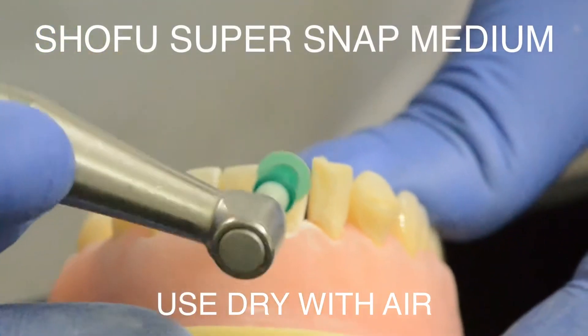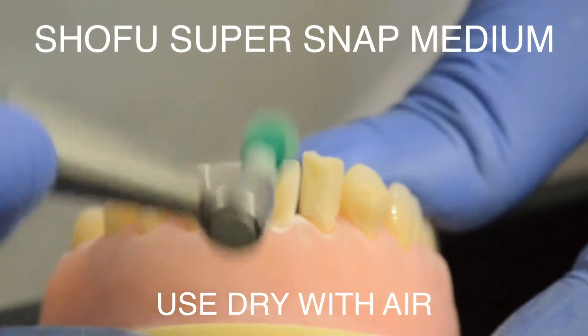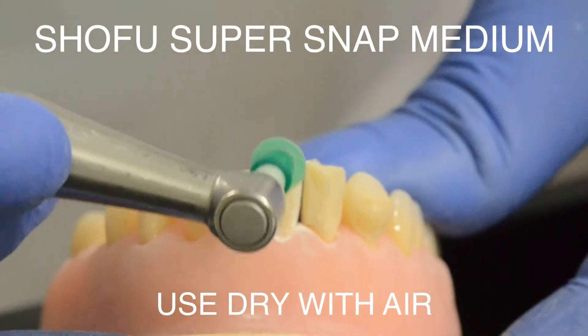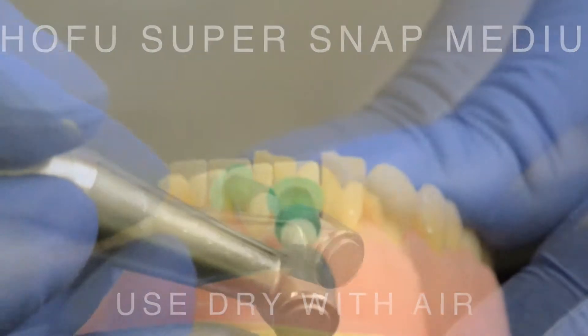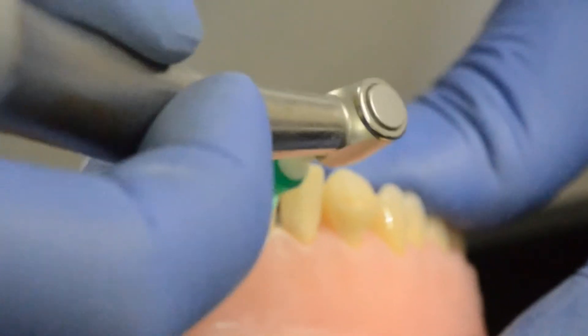Step number three is to use a medium grit diamond disc. In this case I'm using the green color Shofu SuperSnap. You may use anything you like, but most importantly remember that this is still used without water — so have your assistant direct that air.